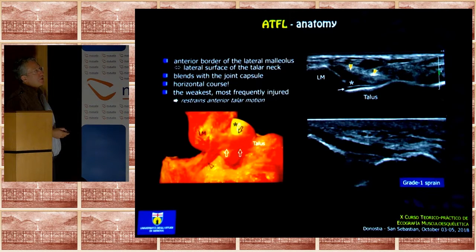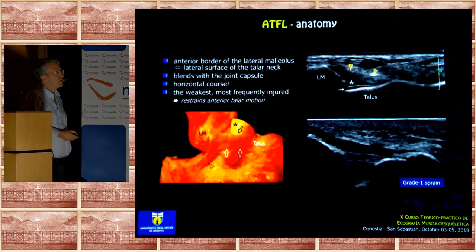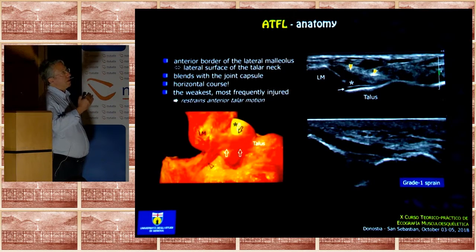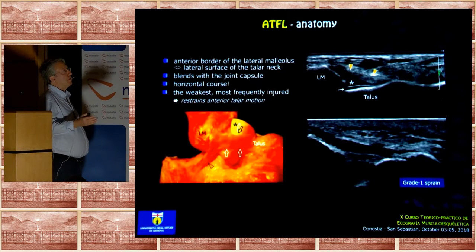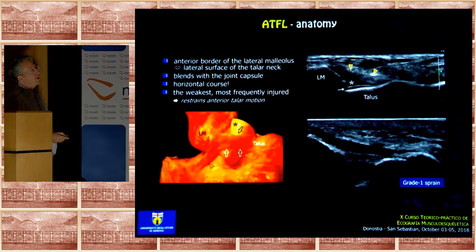This is related to anisotropy in many cases, but a hypoechoic appearance of ligaments may also be related to a grade 1 sprain. So be very careful when you scan this ligament to tilt the probe as much as possible to make the ligament as perpendicular as possible to reduce any anisotropic artifacts. This may help to separate what is artifact from a minor sprain injury.